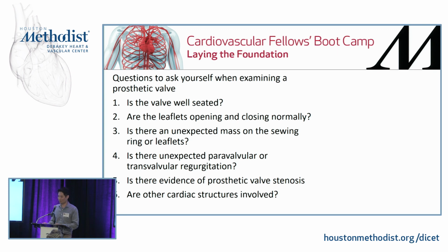Are the leaflets opening and closing normally? Sometimes you'll have a mass that's sitting on one of the leaflets and it's not opening completely, and then you would have prosthetic valve stenosis. So that can happen, so make sure you inspect the leaflets. Check if there's any mass on the ring or the leaflets. If you have endocarditis, you can have something on the leaflets or on the ring. Taking your time and looking at these valves is key to seeing these things because sometimes they can be very small and they could be moving very quickly. So that can be hard.